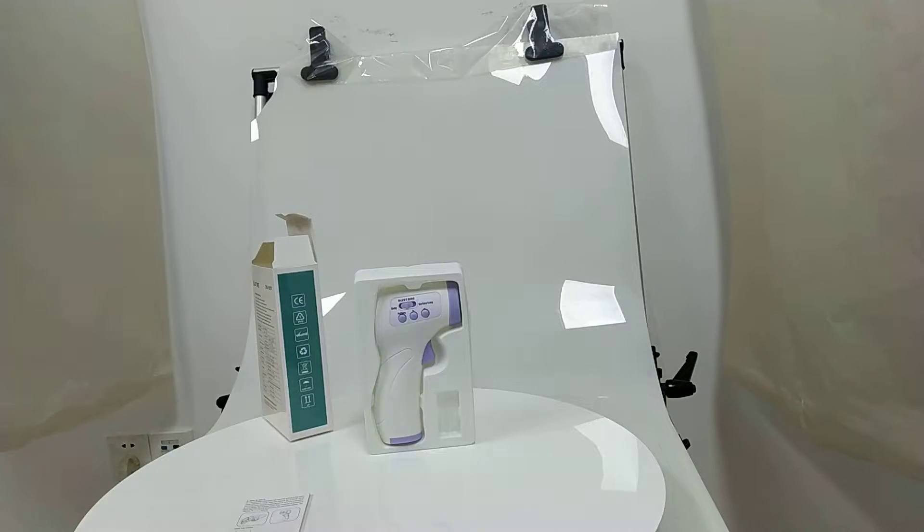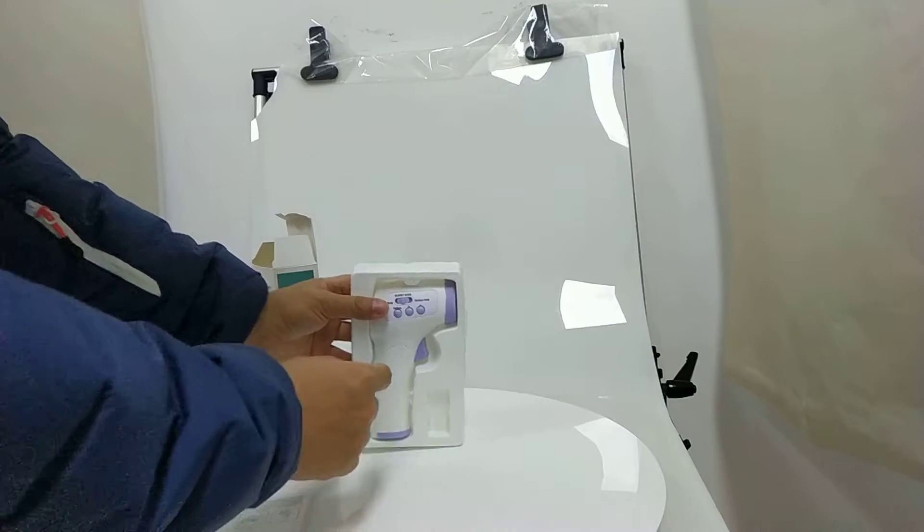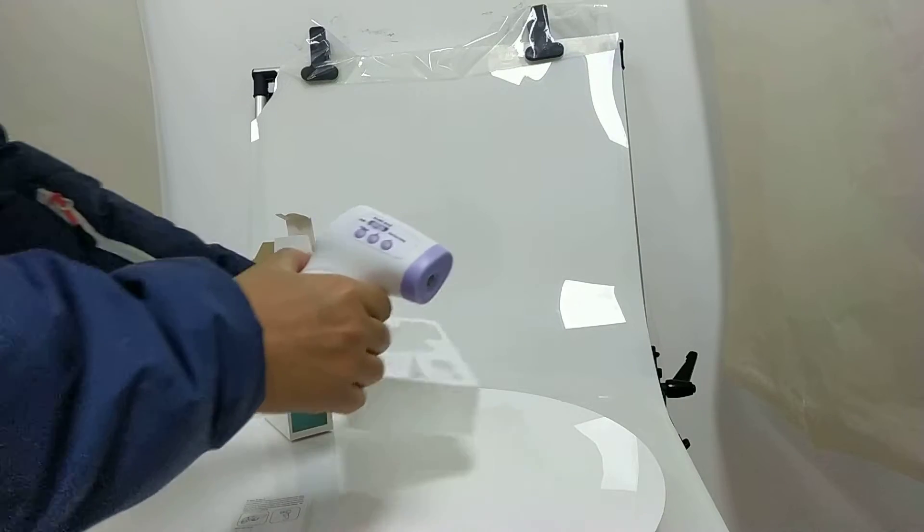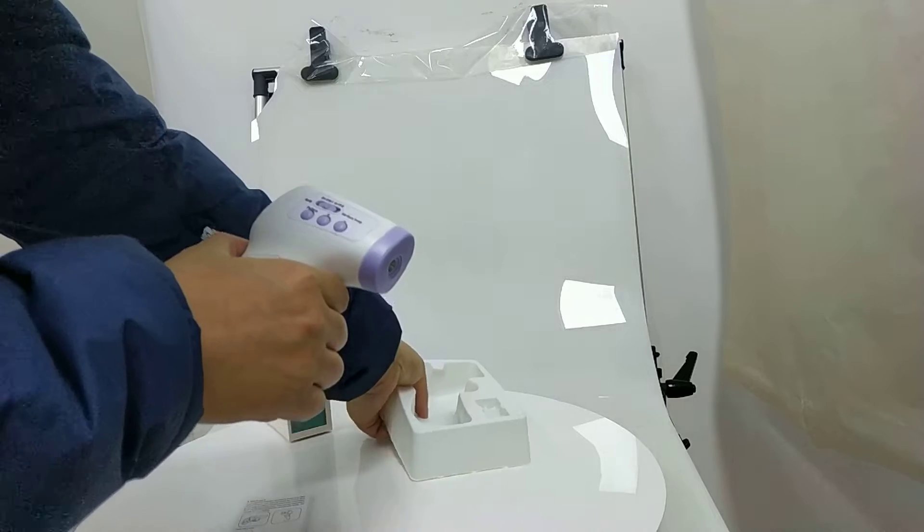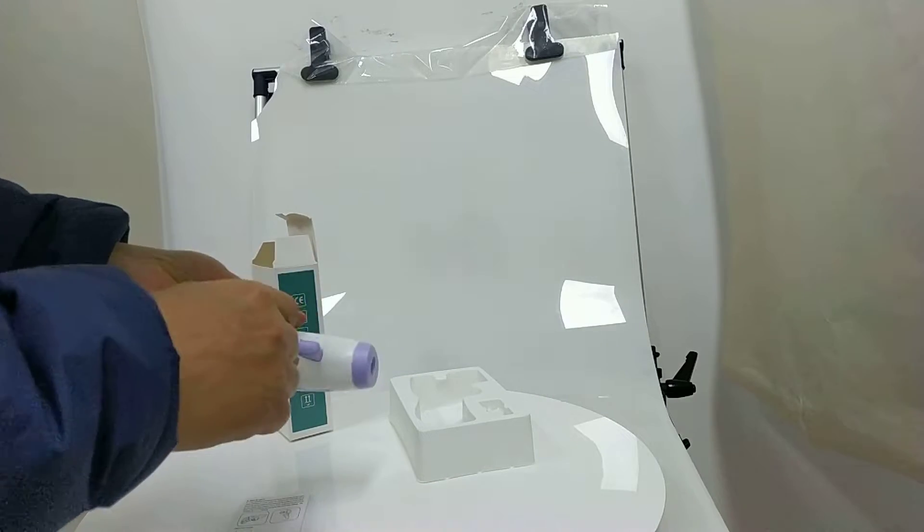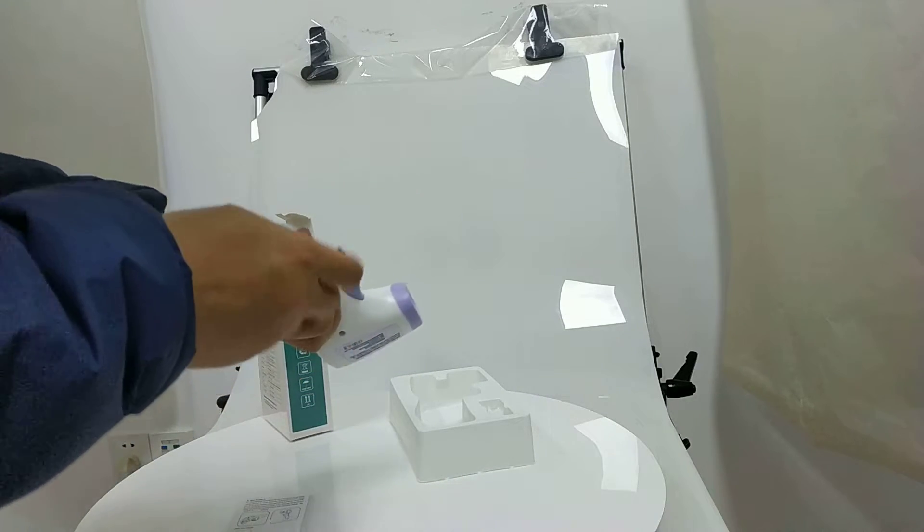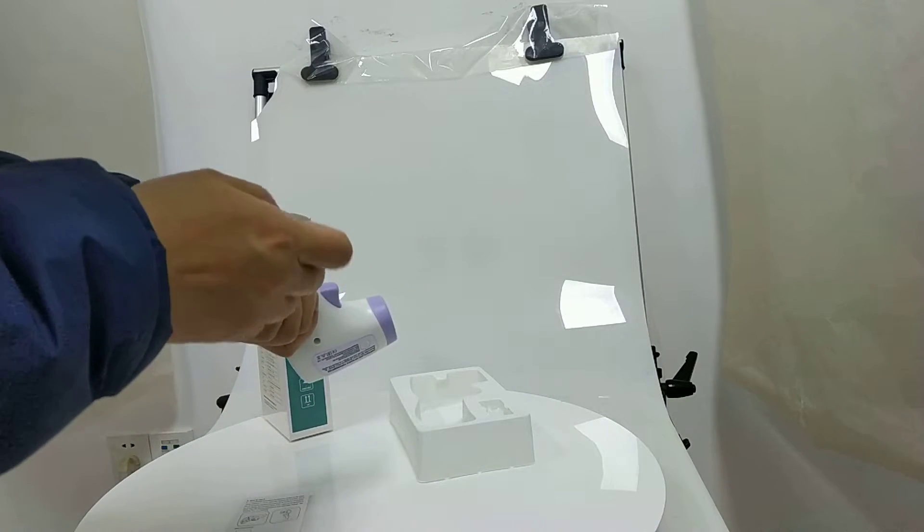This is the thermometer. Put the battery inside.